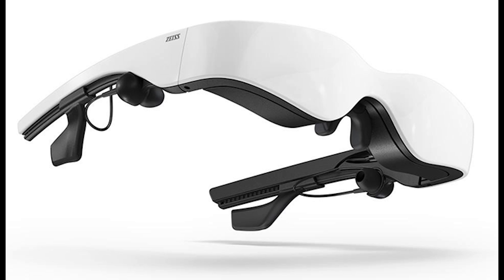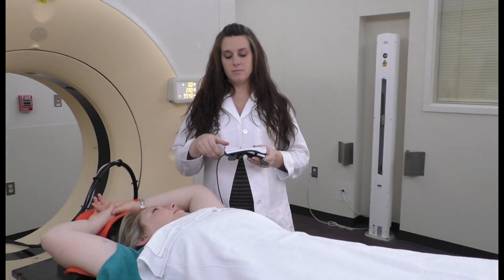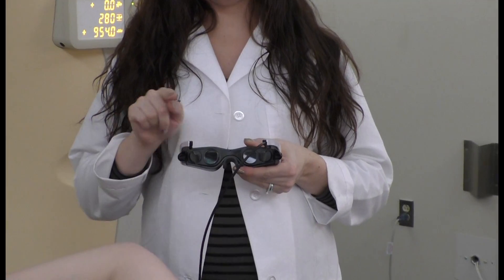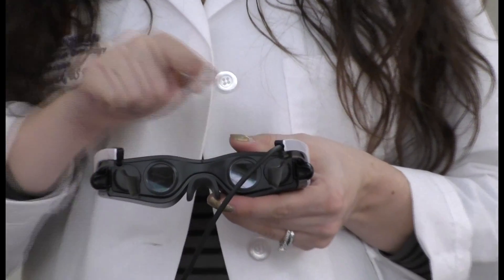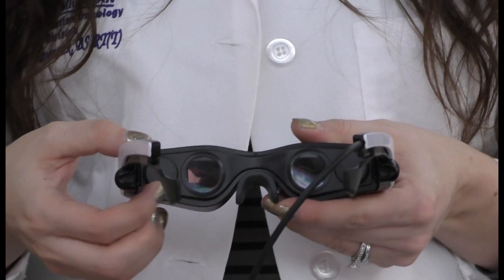The goggles offer virtual reality viewing so you can observe your breathing patterns along with the therapist. What you see through the goggles is what they see on the monitor. If you typically wear glasses, they won't be necessary under the goggles because there is a dial for each lens that allows you to adjust and focus to suit your vision precisely.